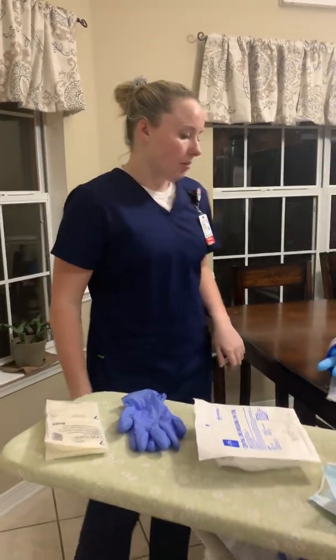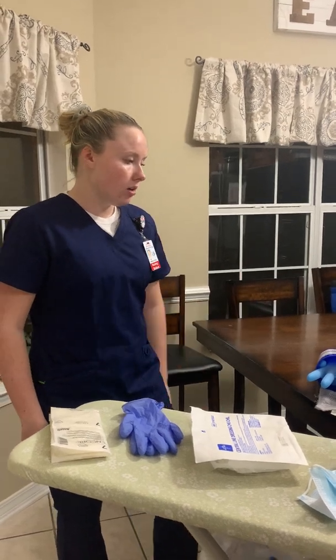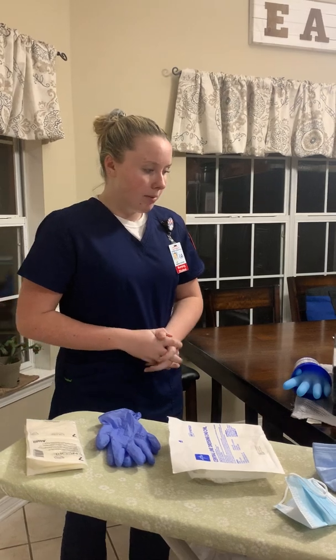I'm going to perform hand hygiene and provide privacy. I'm going to raise the bed to a working height. I'm going to lower the side rails and elevate the head of the bed just a little bit. And then the next thing I'm going to do is assess and palpate the dressing.